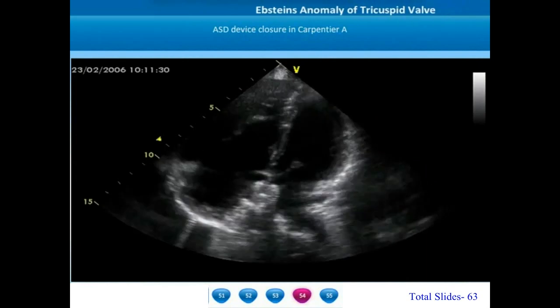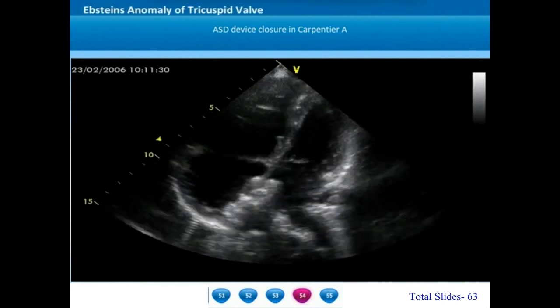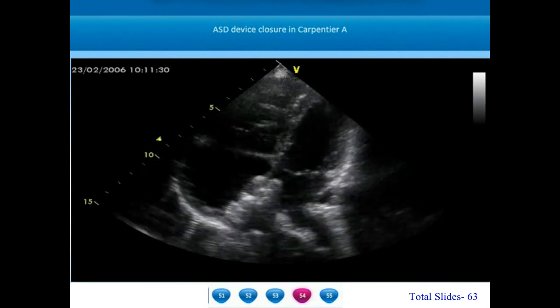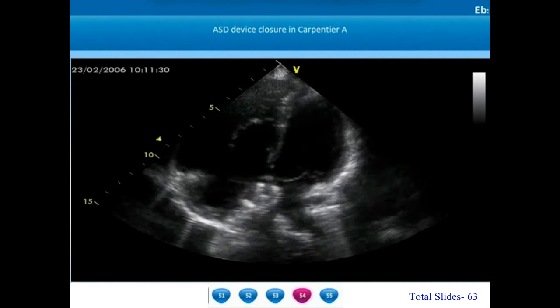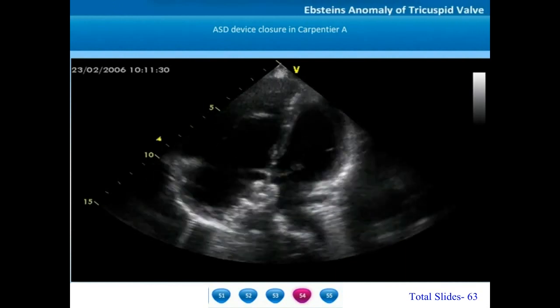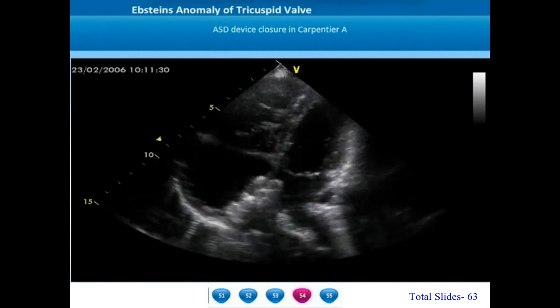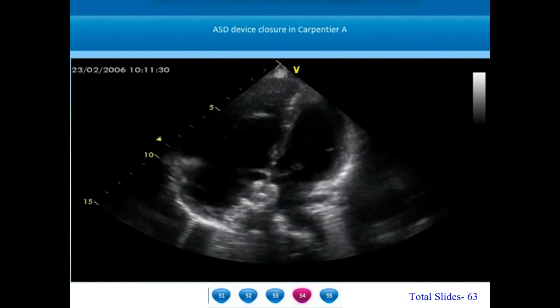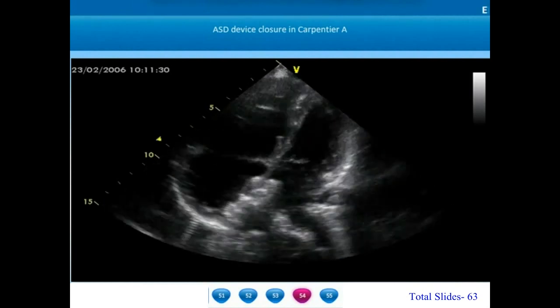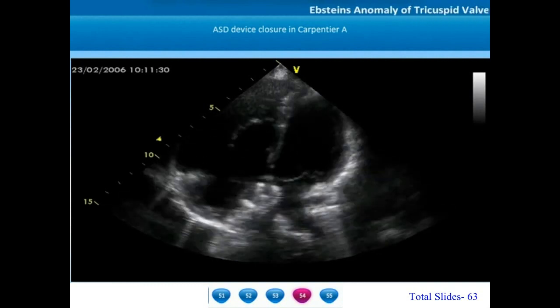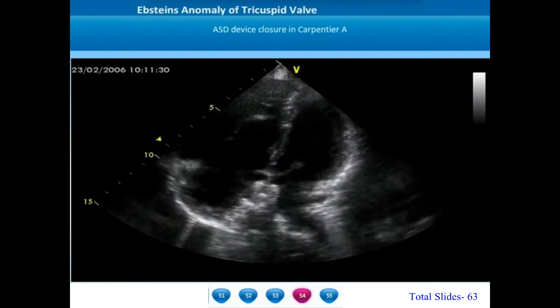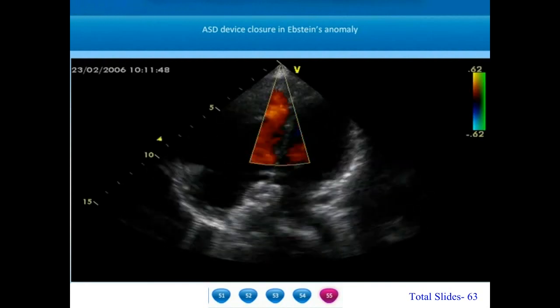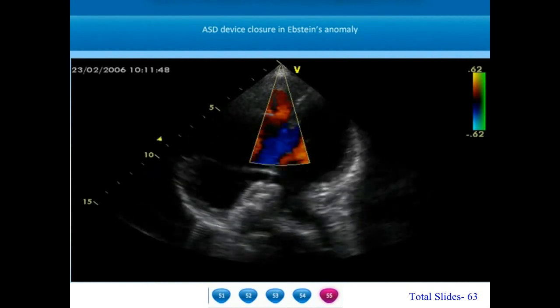In some patients with Carpentier type A Epstein's anomaly where the mobility of the leaflets is very good and tricuspid regurgitation is minimal, atrial septal defects can cause a completely left-to-right shunt resulting in progressive increase of right atrial and right ventricular size. In those patients, there may be a role for non-surgical ASD device closures. This is an example of a patient about 5 years after device closure of an ASD, showing good mobility of the anterior tricuspid leaflet, minimal dilatation of the right atrium and right ventricle, a very small narrow jet of mild tricuspid regurgitation, and well-preserved right ventricular systolic function.